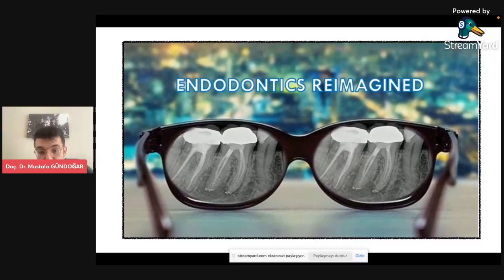As you see, the one on the left side is a normal root canal treatment where you don't see any isthmus areas or lateral canals that are cleaned very well. But the one on the right is the real root canal treatment that we want to see radiographically nowadays. We want to clean and obturate areas like isthmuses, lateral canals, and all the apical foramina. This is why we use the term endodontics reimagined.